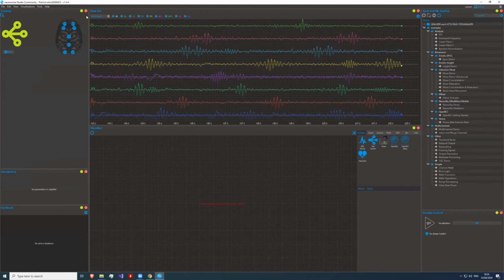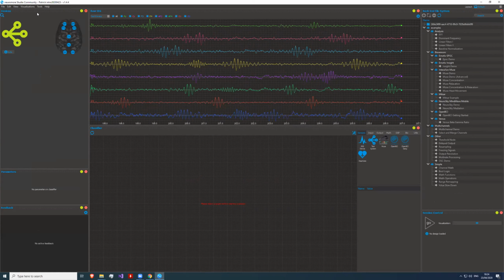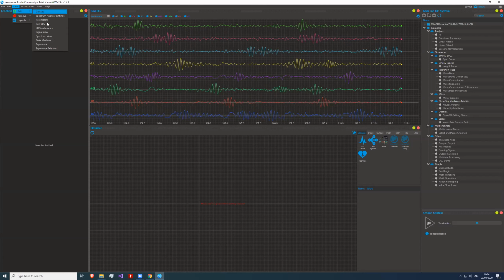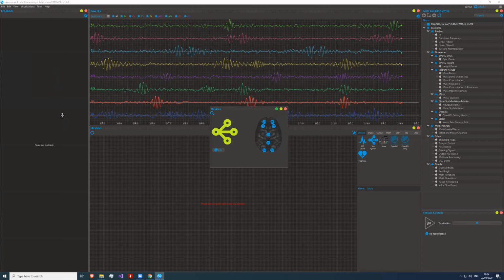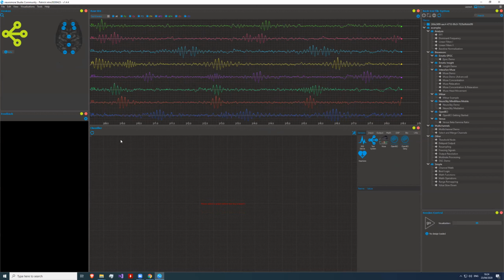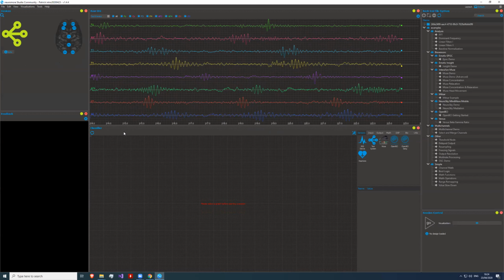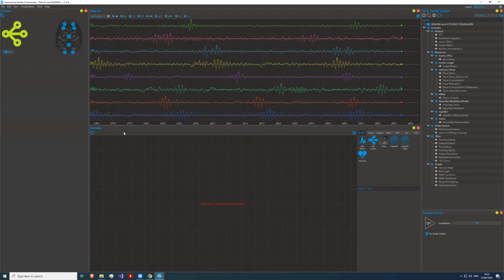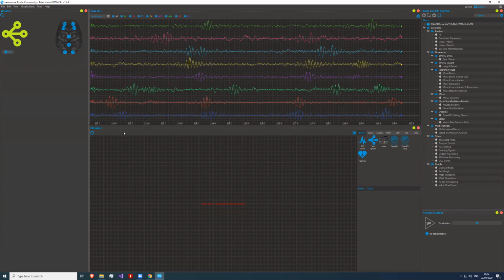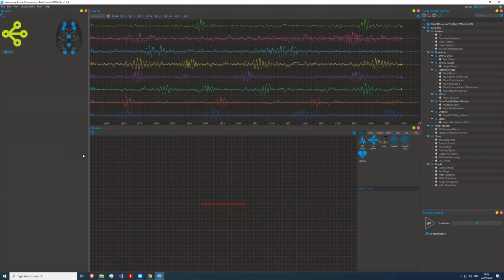In case you close one of those windows and want it back, you go in View, then Add, and say, there's the devices window, and we just bring it back. It's a pretty neat system that can be used for the windows and controls that we already created, but it also enables you to easily create your own window, your own control, whatever you want to see in the neuromore Studio that's currently not there.